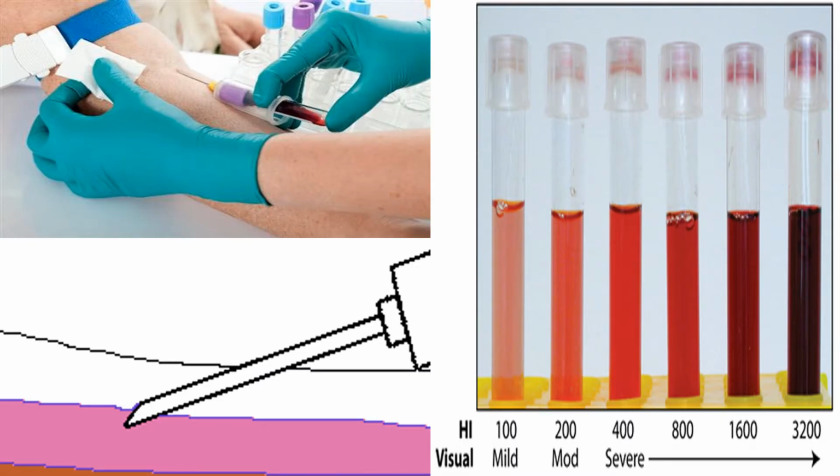The pictures shown on this slide are examples of situations that may promote premature activation of the coagulation cascade. You have here the first picture. It could be that the process of collecting a sample is traumatic.